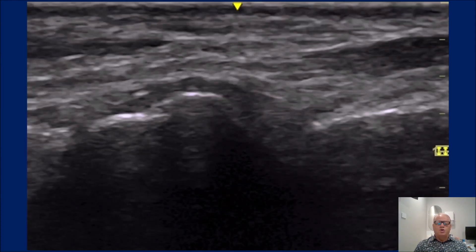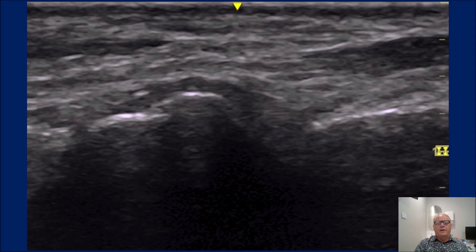And this is what it looks like. This is a normal ligament. You can see here a normal dorsal talonavicular ligament.